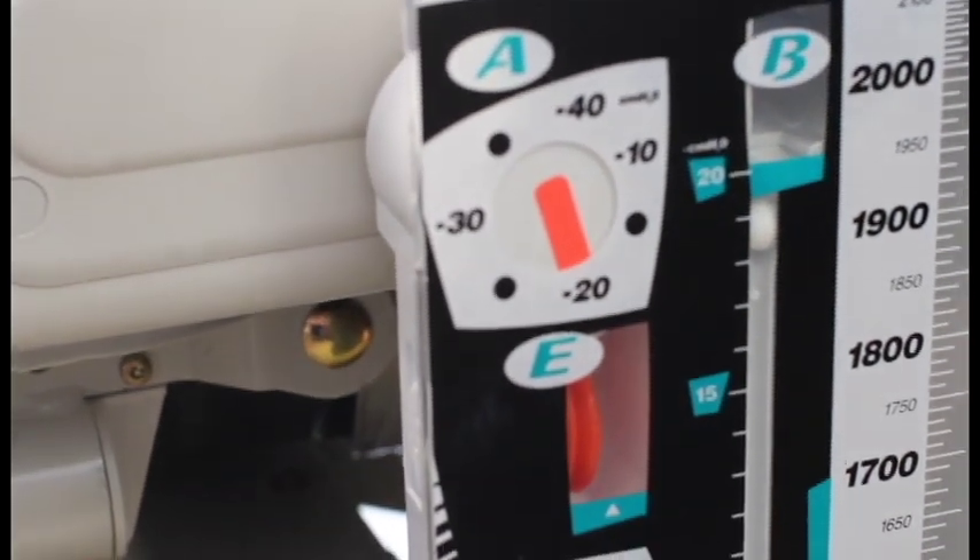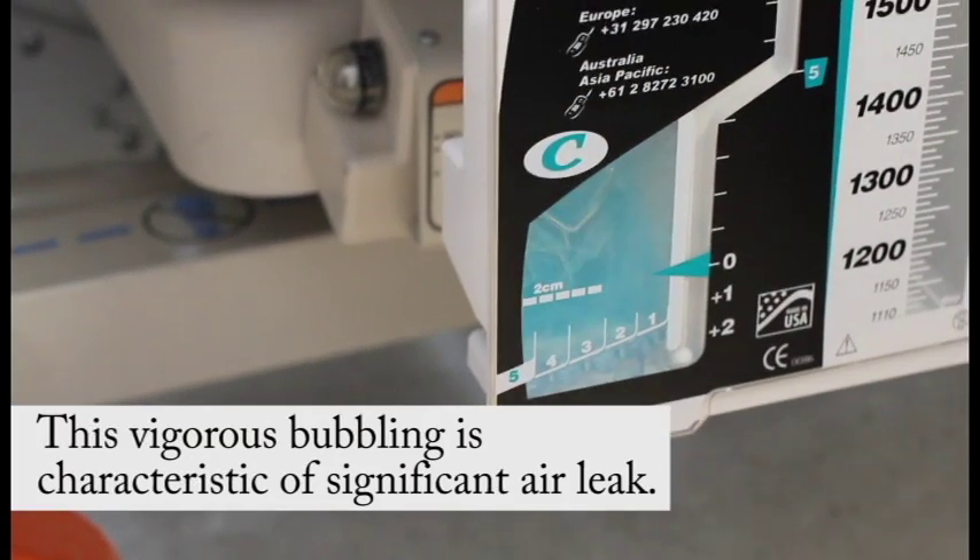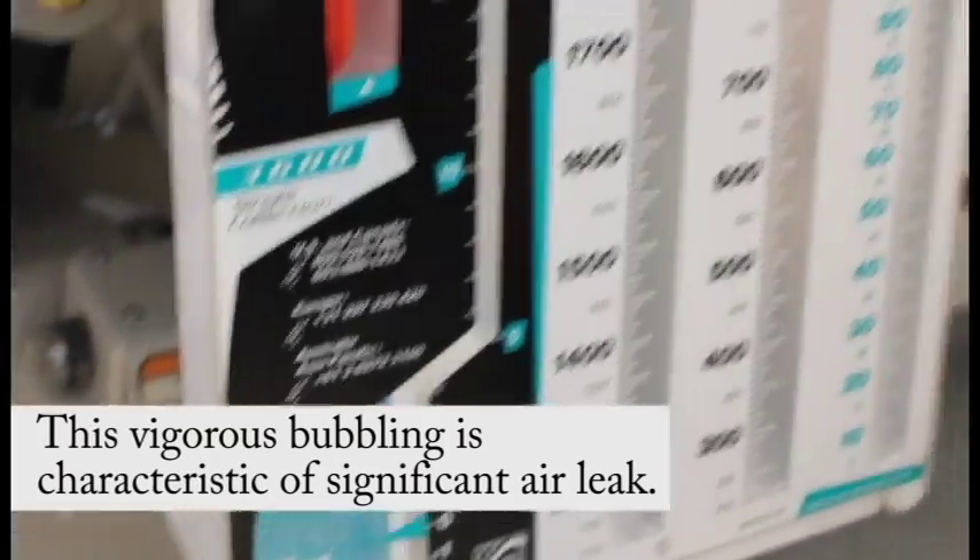Assess the air leak meter for gentle, continuous bubbling or tidaling. Water in the water seal chamber can evaporate, so always check the water levels.